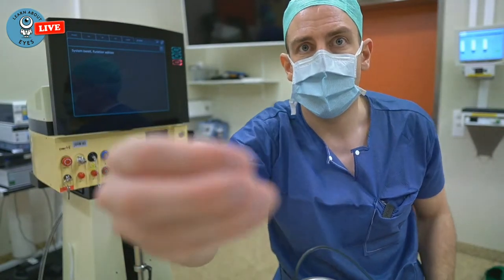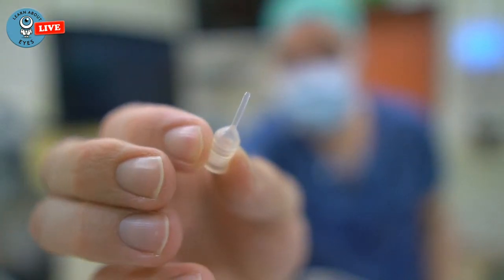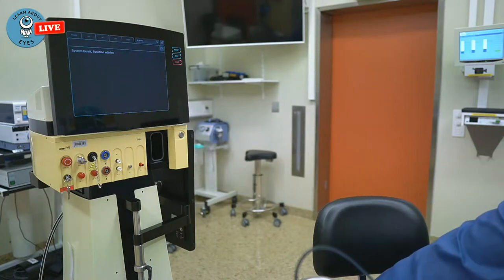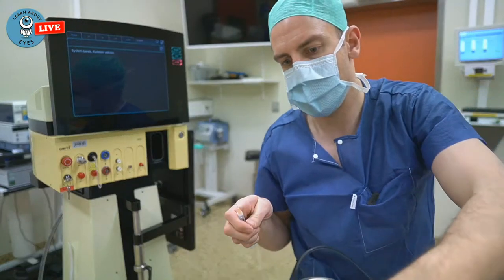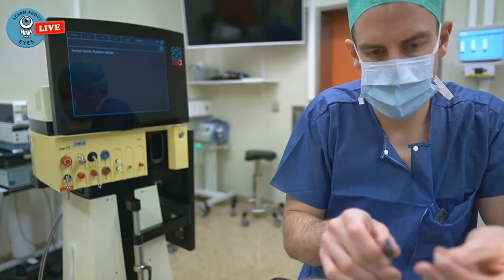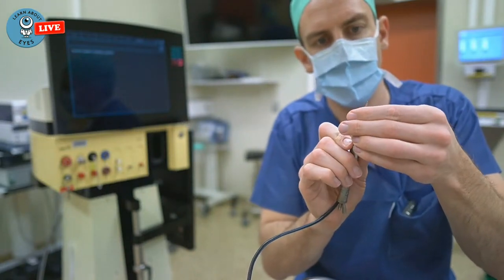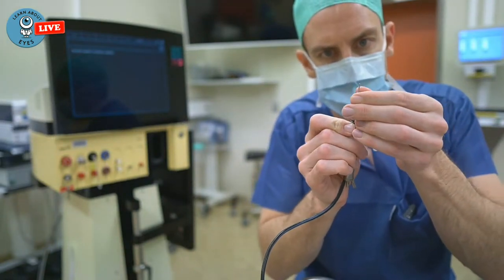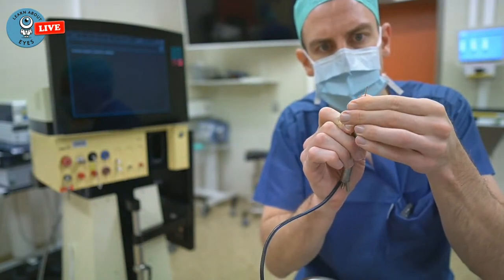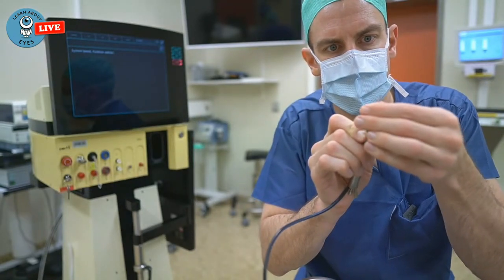And then to put on the sleeve, it's usually pretty good to make it a little bit wet. So I'm taking a bit of saline, putting it in there, and then we can slide that phaco tip on. Take care not to go out of the side holes. This can be tricky. Okay. Should be fine like that.